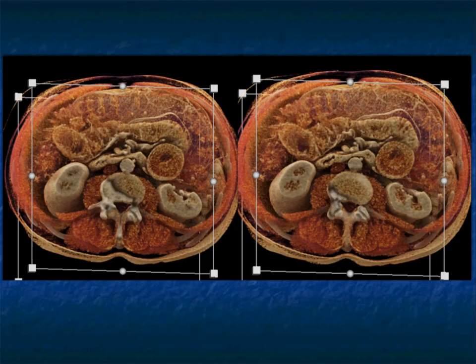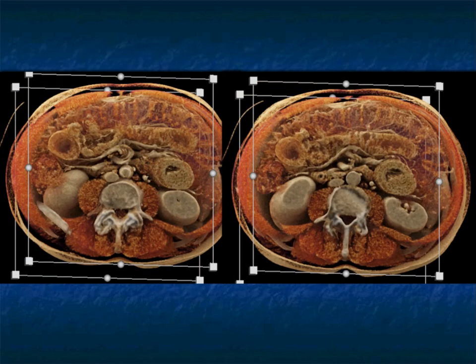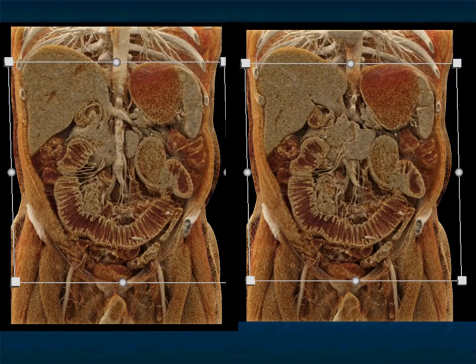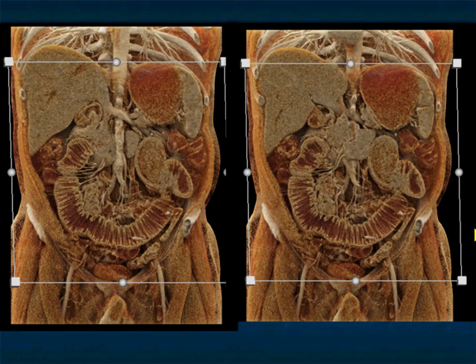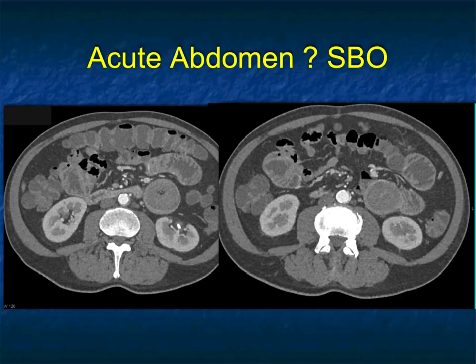This is beautifully shown on the cinematic rendered views as well. You can see the loop appearance of the intussusception and the proximally dilated bowel. I like cinematic rendering for volume projections — it gives you a good feel, and I think cinematic will be used more in the future as it becomes a standard. Beautiful look at the fold pattern and the intussusception right there.